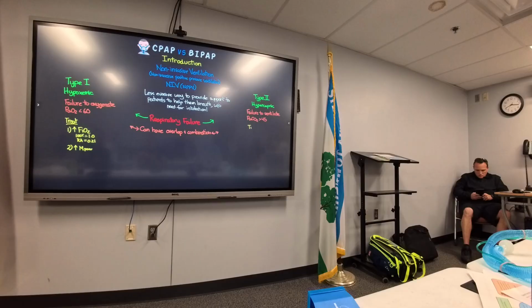Now, our treatment option for our hypercapnic respiratory failure is actually pretty simple, and essentially we need to increase our patient's minute ventilation. Now, the way that we can do this is through two different things. We can either increase their respiratory rate, or we can increase their tidal volume. Now, given that we should be setting a tidal volume based on our patient's ideal body weight, this really kind of leaves us one option of adjusting our patient's respiratory rate if we want to impact their minute ventilation.